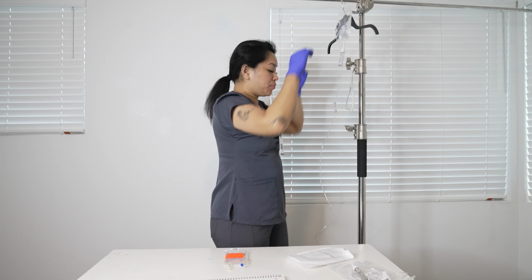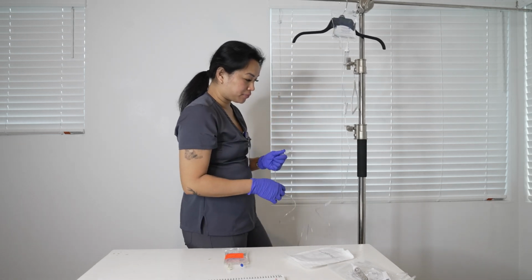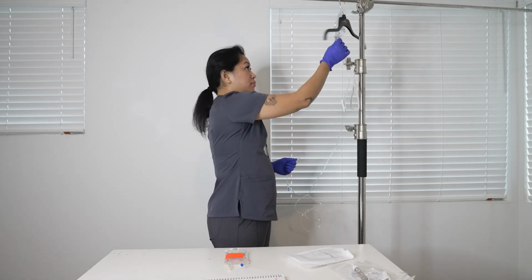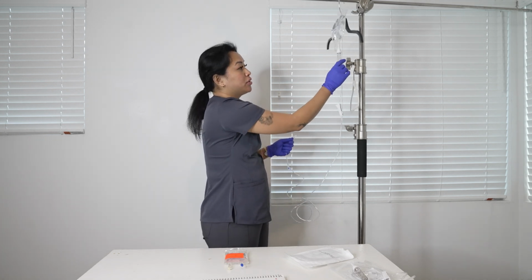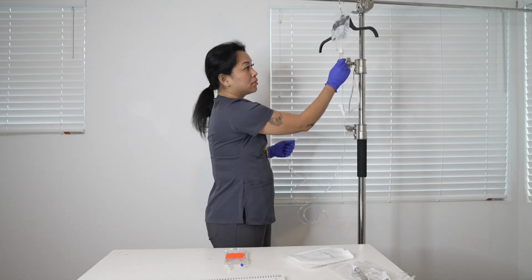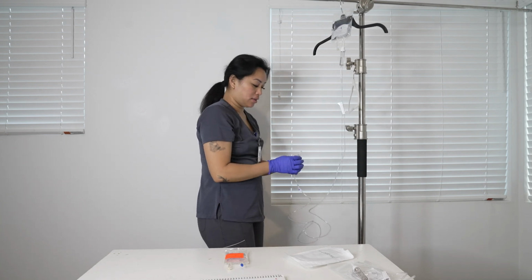Alrighty. So now I'm going to prime the tubing. I'm going to ensure that there are no air bubbles. So now before I prime it, I have to fill the drip chamber up halfway. Alright, so the drip chamber, it is halfway.